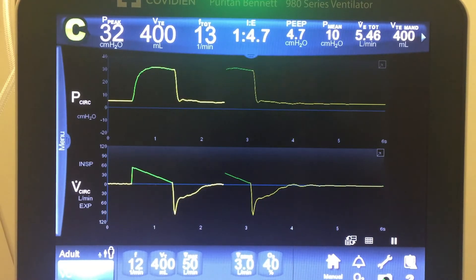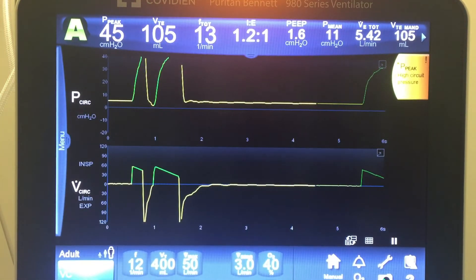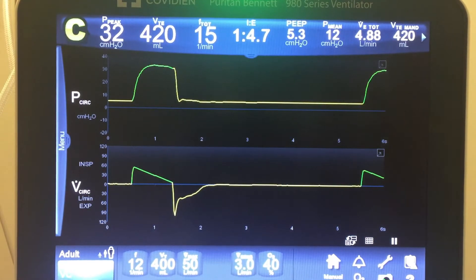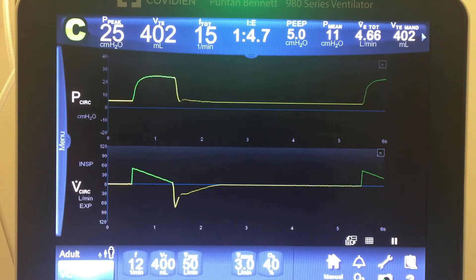Now let's see what happens when it hits the high pressure limit. The limit is set at 45, so I'll make the lung even stiffer — and it hops right up to 45, where it alarms. Now I'll remove the weight and let the lung return to normal compliance. It drops back to 25 in one breath. In regular VC, pressure jumps and decreases all in one breath, and when it hits the high pressure limit, the rest of the tidal volume is dumped so pressure doesn't keep rising.